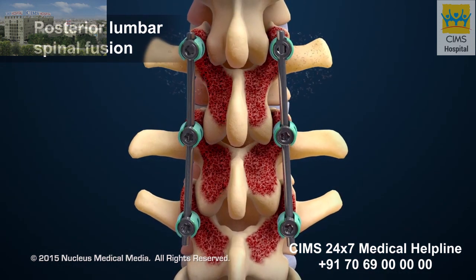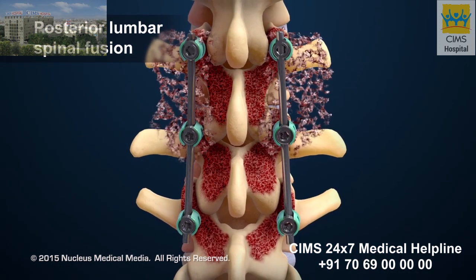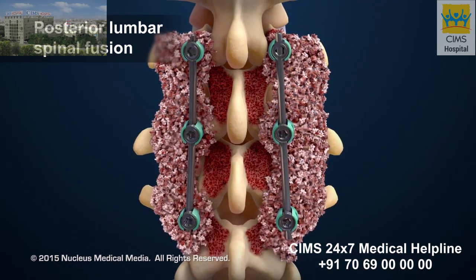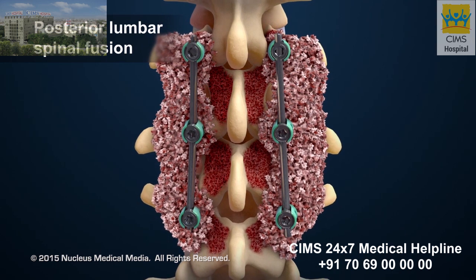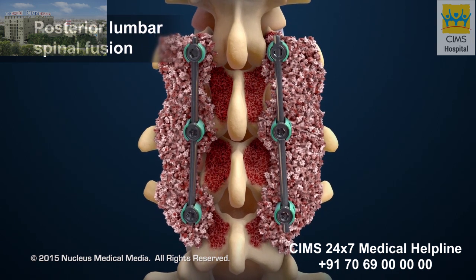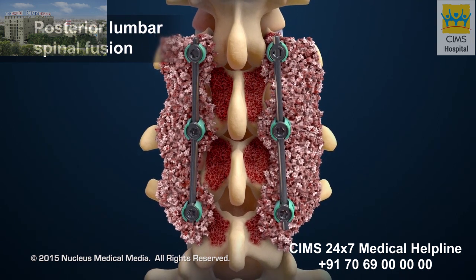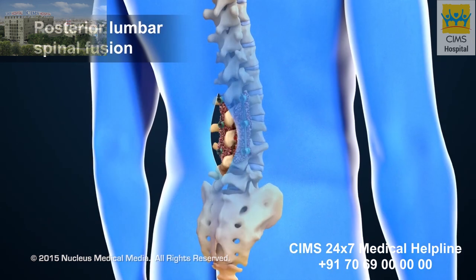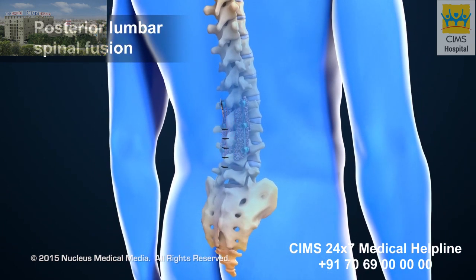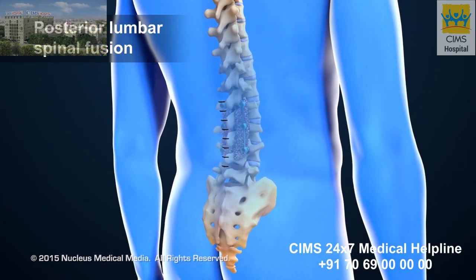The surgeon will place the bone grafts along the spine to allow the vertebrae to grow together and keep the spine stable. At the end of the procedure, the skin incision will be closed with stitches.